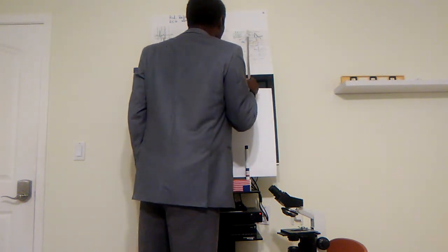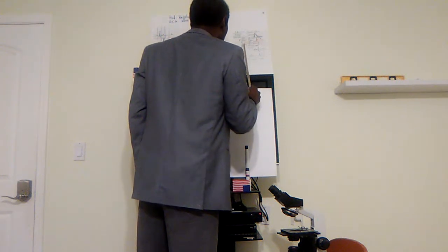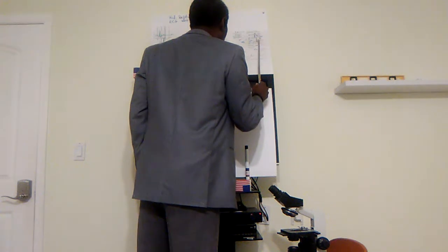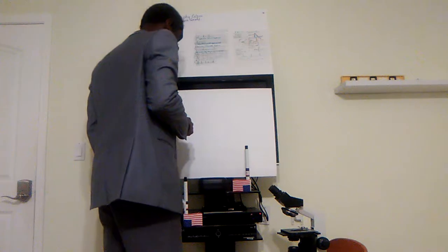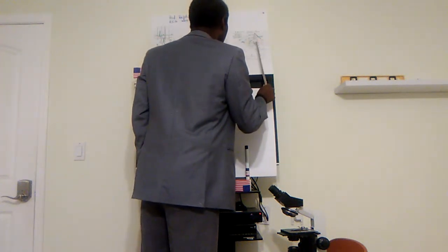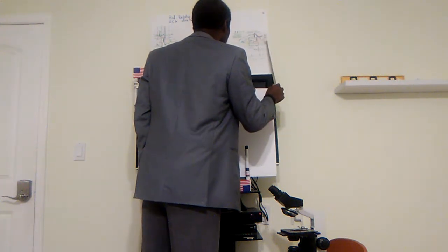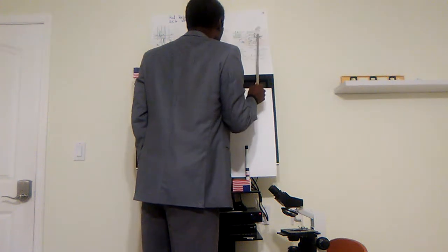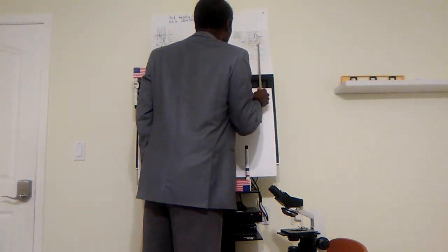And thirdly, we have the AV node, and this is the signal representation of the AV node. And then fourth, we have the common bundle, and this is the fourth signal. And the fifth, we have the bundle branches here, shown in yellow.